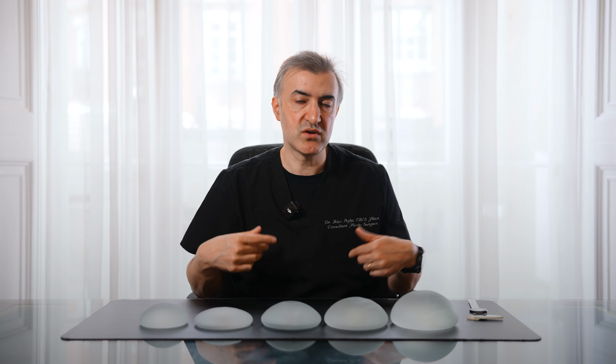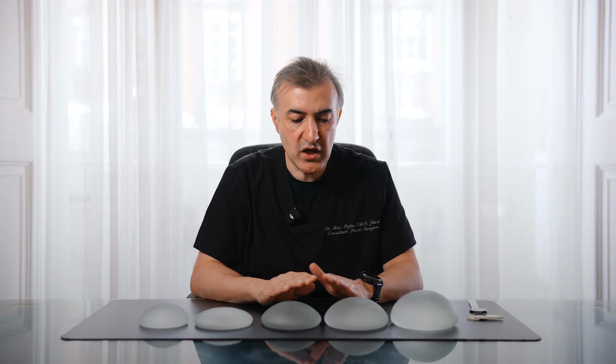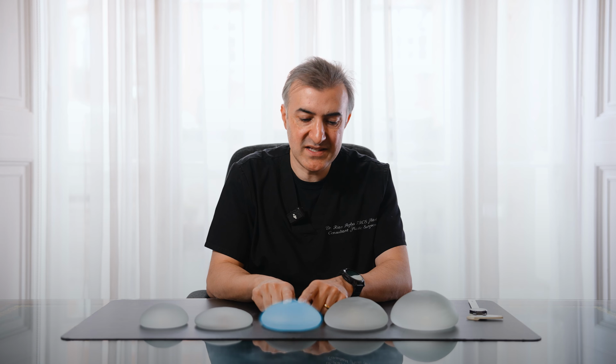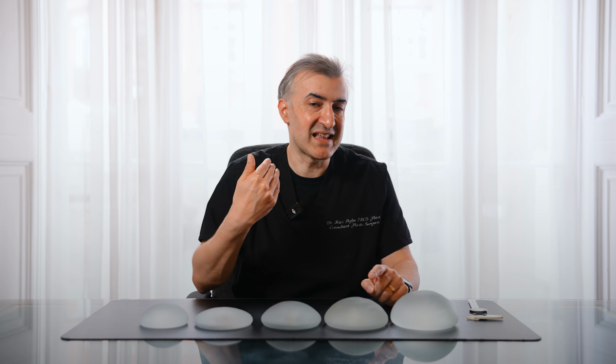They can put their shirt on, they can take selfies, they can take photos, and that helps give an idea about what they want. And obviously, you can only do what you can accommodate within their own soft tissues and how much of a capacity their pocket will ultimately have. And that's based on your look, feel, move exam. So they may be able to accommodate this one and this one, or this one and this one. They may have already got breast implants, and that gives you a degree of understanding about the size that it can accommodate, how much loose tissue they've got, what's happened over the passage of time.